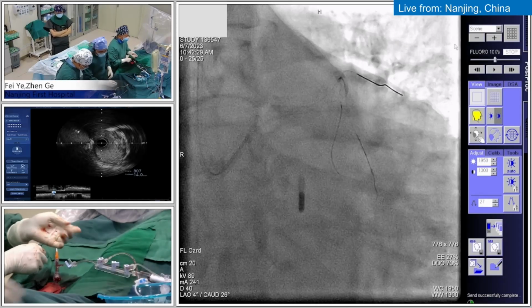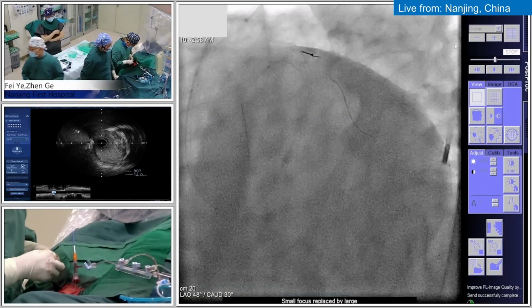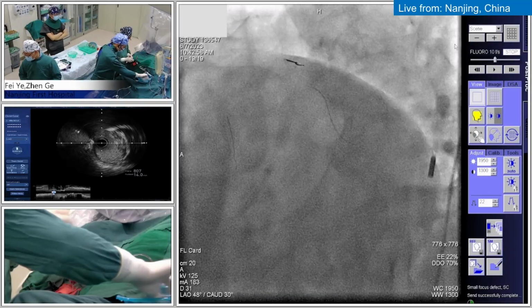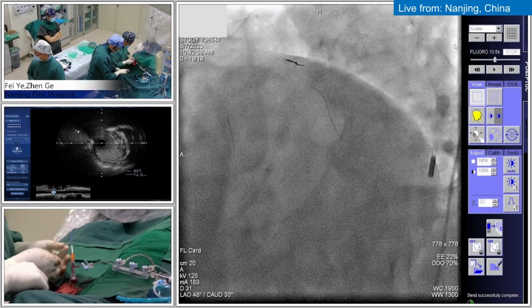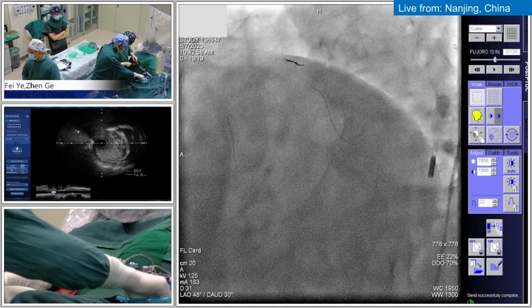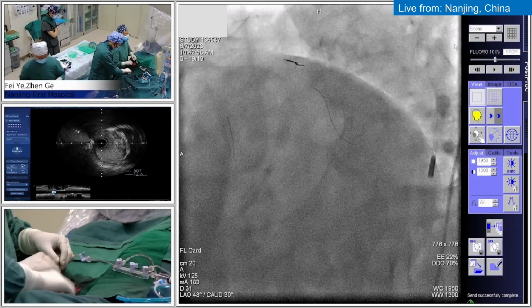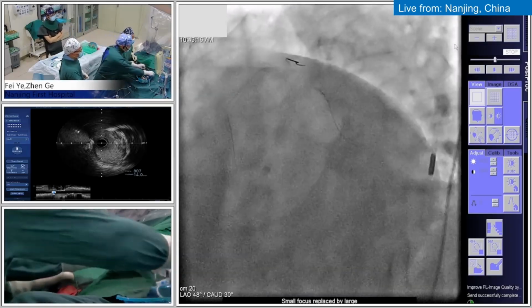Okay, that's about the view. So we still don't know, for the one stent tactic, a crossover tactic from the LAD to the left main for this left main bifurcation, and if there is no influence of the side branch of the circumflex and the ramus, do you perform the kissing or not routinely? That's a great question.